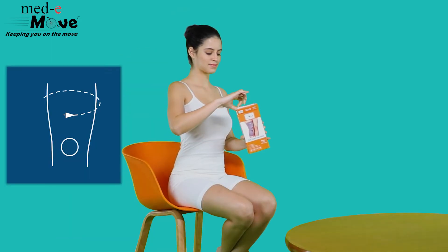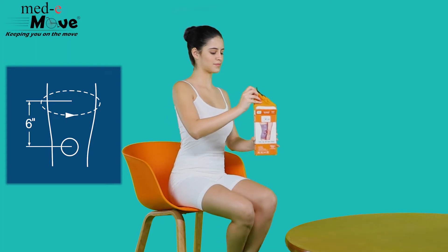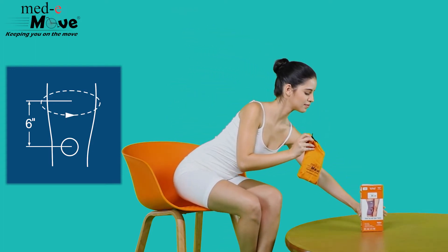Measure the circumference around your mid-thigh approximately 6 inches above the knee joint and refer to the chart printed on the box.